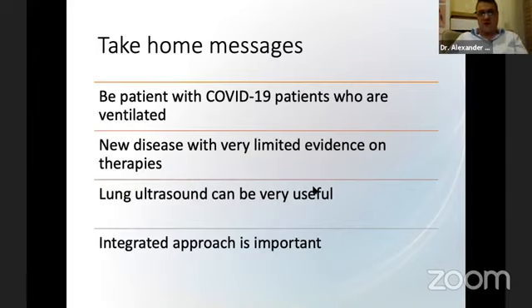So you are actually not restricted by the fact that you have just old technology. You can just find an old echo machine in your unit. You can dedicate it for a COVID patient to avoid disease spread. And it's much easier to learn lung ultrasound than, for example, transthoracic echocardiography. So I think anyone who's dealing with this patient has to start doing it, and there's no limitation based on machines and availability of machines.